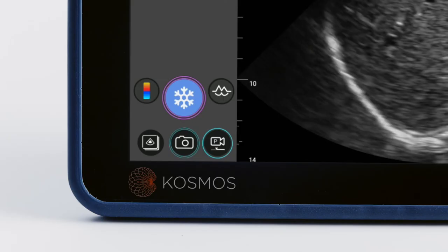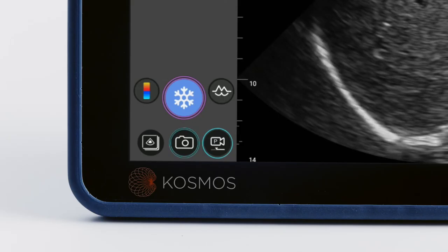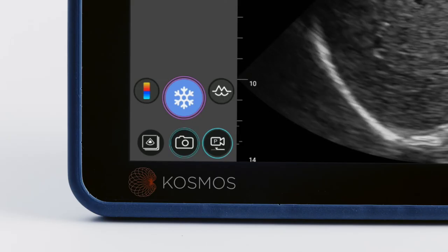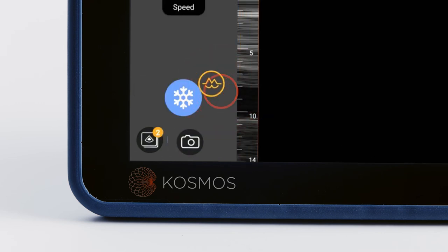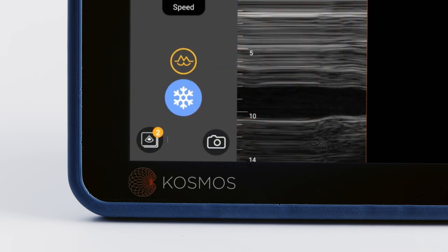If you would like to measure motion over time, turn on M mode by tapping the M mode button on the screen.